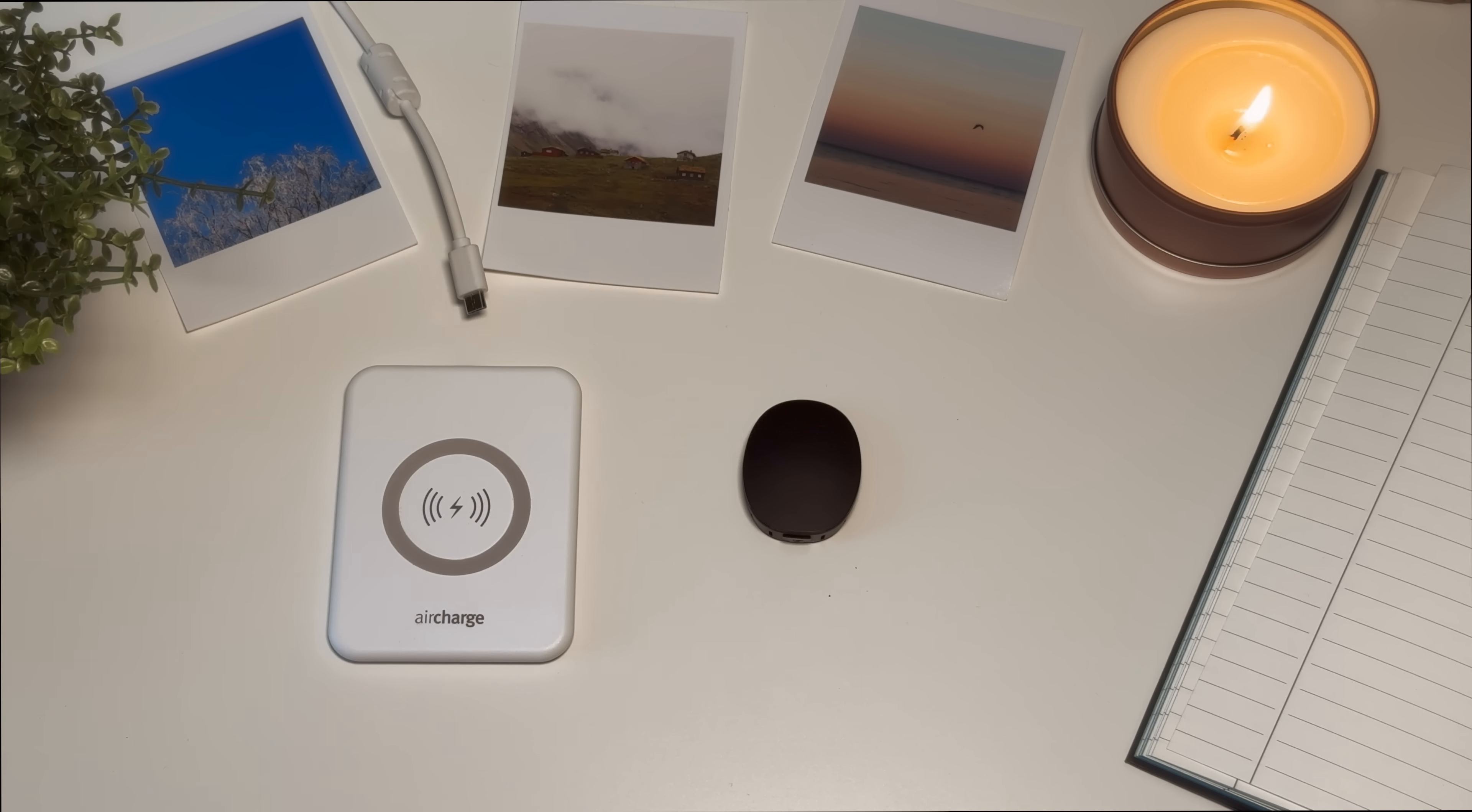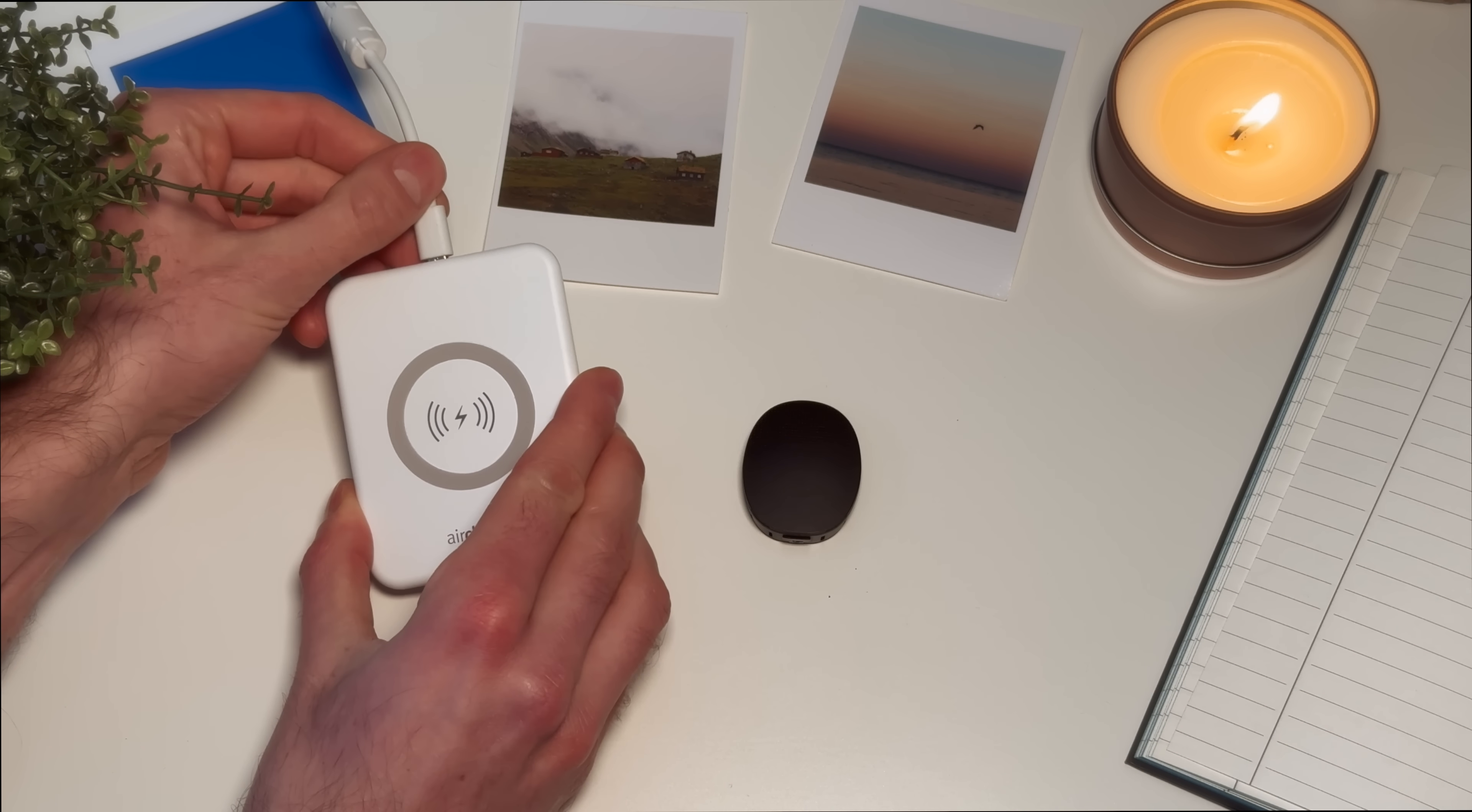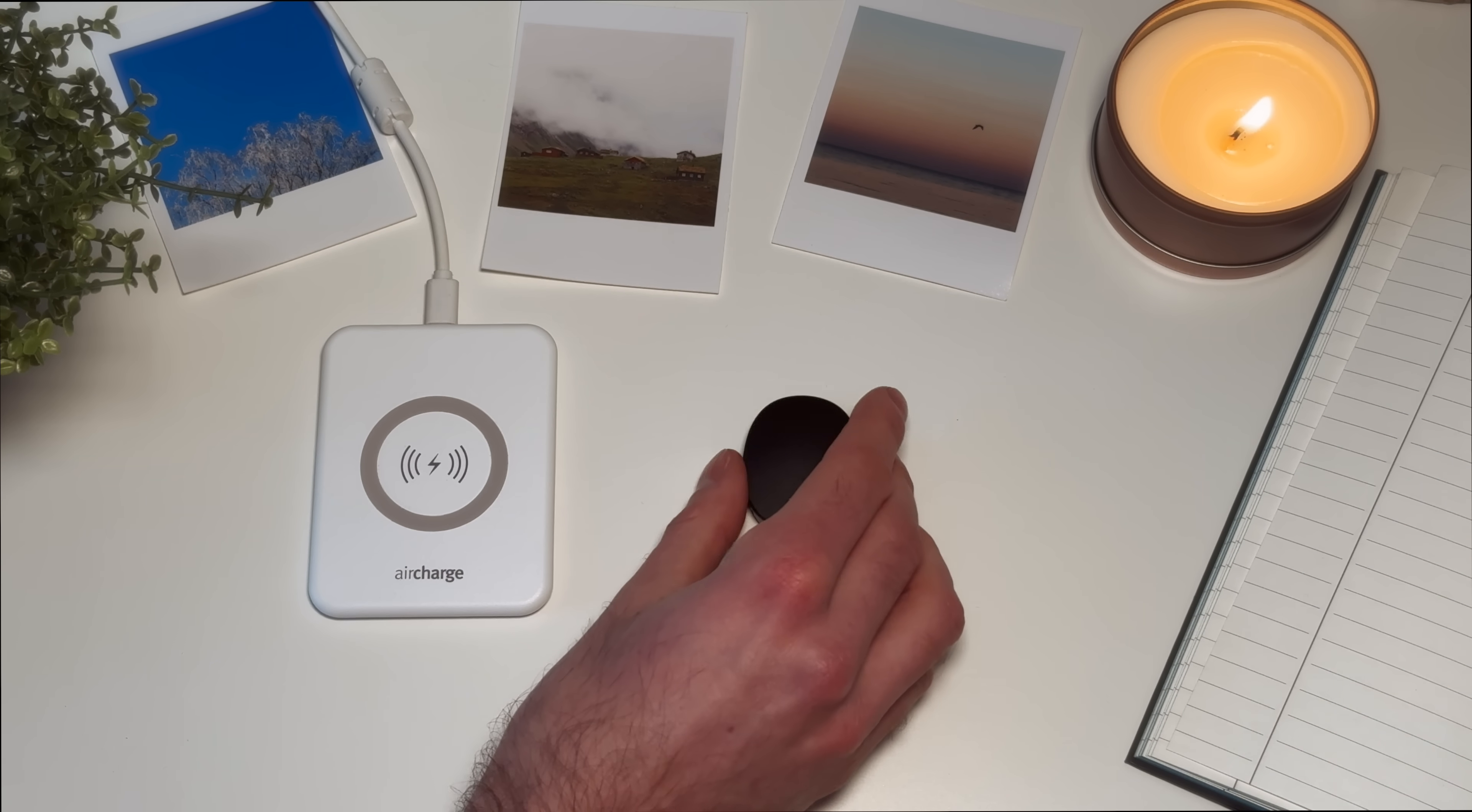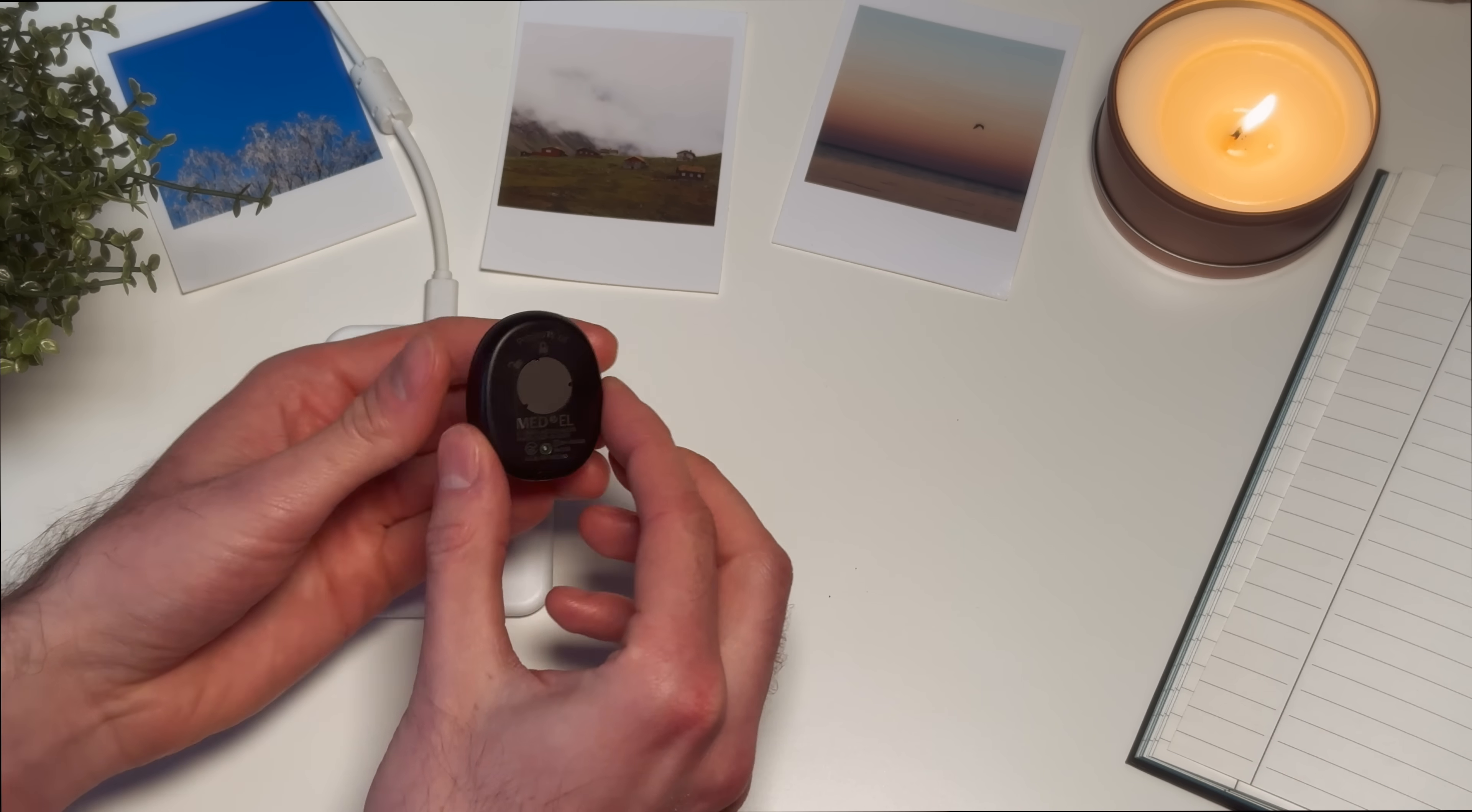Plug the other end into the wall plug adapter or a USB port. Place the RONDO 3 on the wireless charging pad with the MEDAL logo facing upwards. Make sure the MEDAL logo is at the exact center of the charging pad.